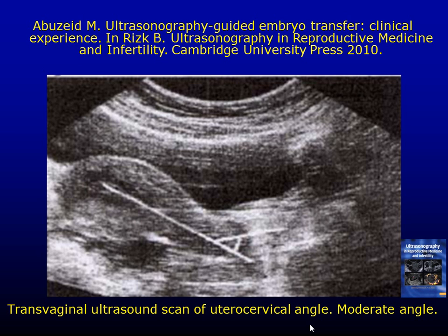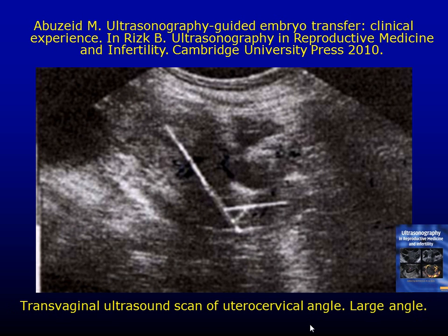So you put your catheter. So typically you want to put the whole catheter in, take the inside out, and then feed the other catheter through. And then this one probably had a previous C-section, so her uterus is stuck to her anterior abdominal wall. When she coughs, the uterus moves up and down. So that angle is there. Again, you have to put it in. Unfortunately, it is helped by traction, but we don't like traction because it releases prostaglandins and ends in a much higher expulsion rate of the embryos, even if you don't have any bleeding or anything like that.